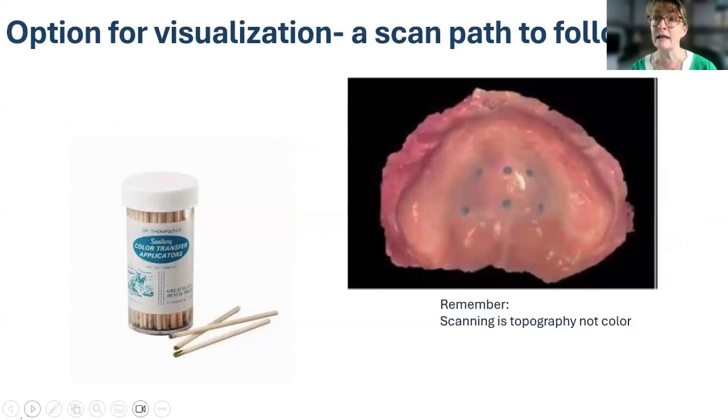The other is scanning that edentulous intraoral cavity, which Yen, you mentioned. This is a little tool. Sometimes these little tips we come up with. So Dr. Thompson transfer sticks. I don't necessarily do the 3 dots on the palate. If this is the palate and this is a rugae, I will mark with some X's the post-dam area, right? The post-palatine seal. And maybe do a little Christmas tree on the top of the palate. And the only reason I do that is for my own eyes to digest the information.